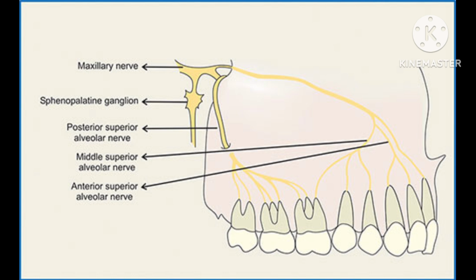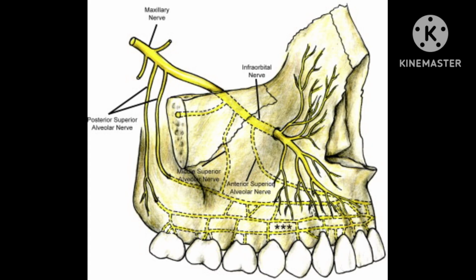Anesthesia on the buccal vestibular side, teeth. The anesthetic solution is injected as a depot locally at the apex of the tooth to be anesthetized. The needle tip should be placed as close to the apex as possible. Incisors: the needle is inserted angled toward the apex while the mucosa is kept taut. Canines: the needle is inserted parallel to the tooth in the canine region where there is ample space.